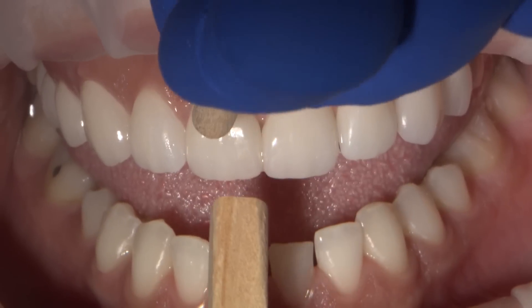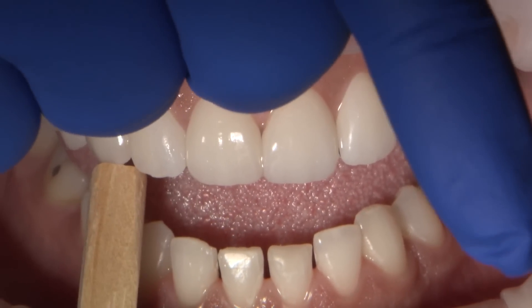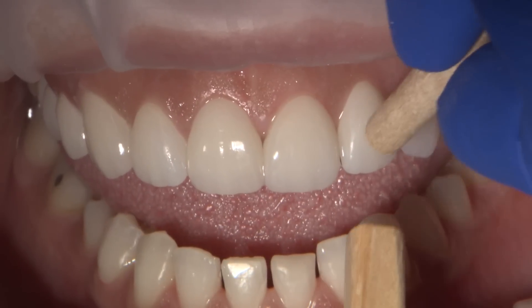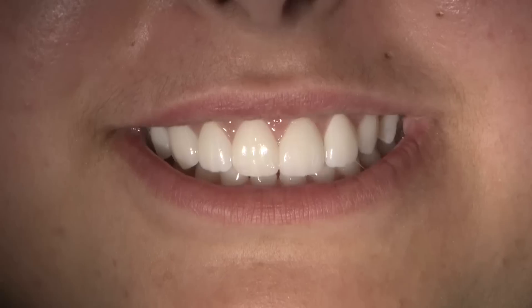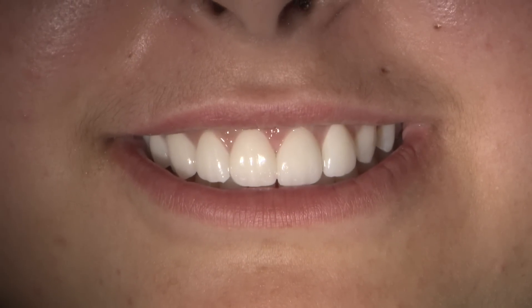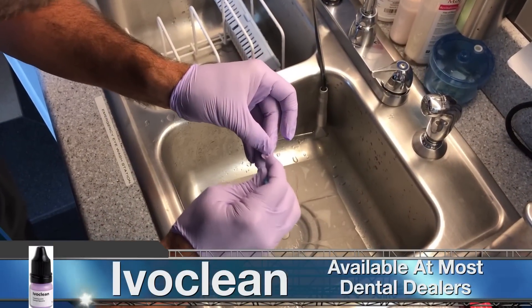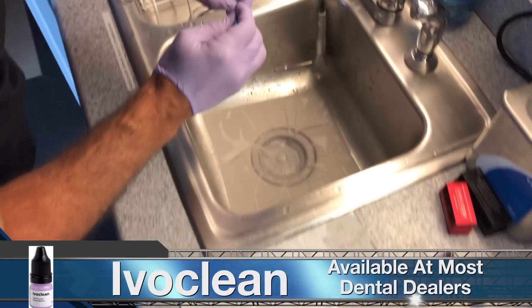We can try in the restorations with water or with try-in paste. I feel that I have a better appreciation of the margin integrity if I just use water. After confirming the fit, function, and phonetics are good, we are getting ready for the bonding procedure. After the try-in, we decontaminate the intaglio surface from the salivary phosphates by using Ivoclean.